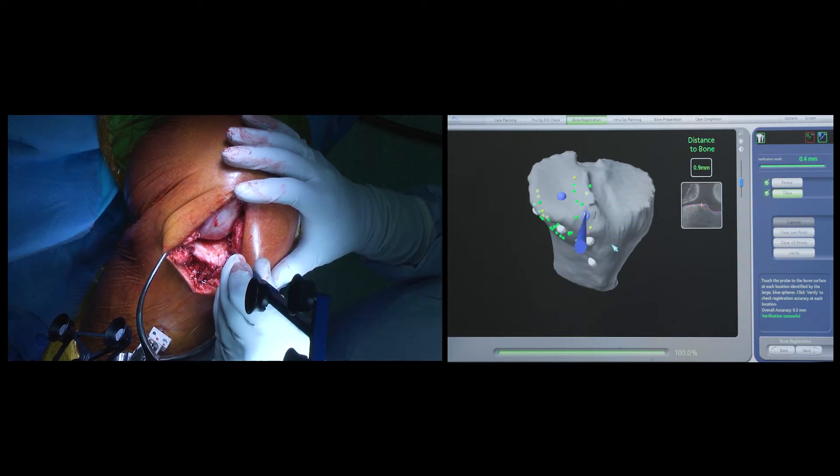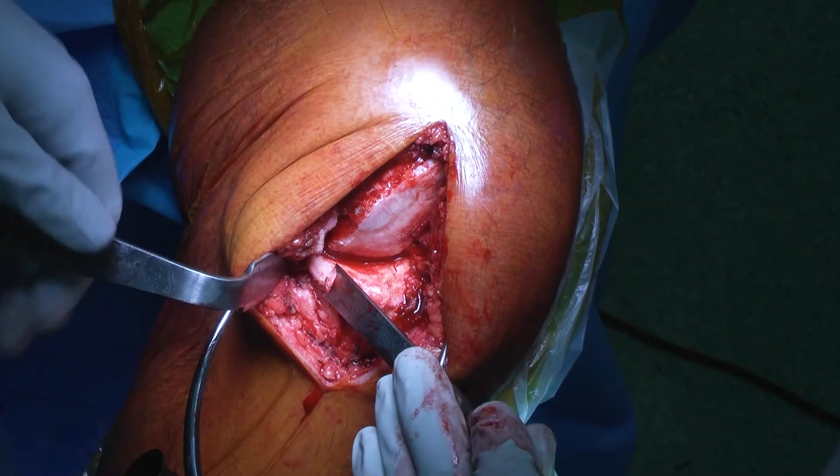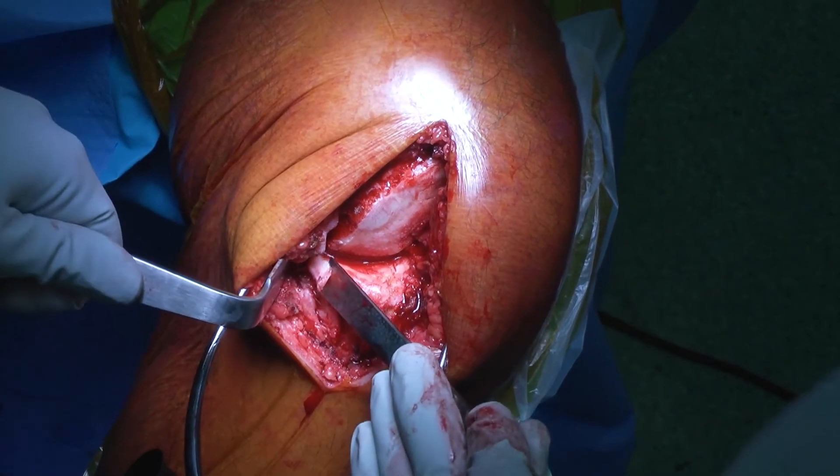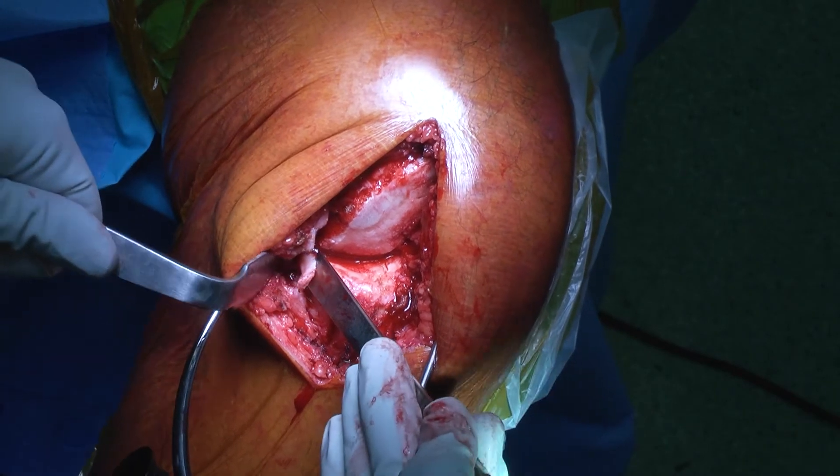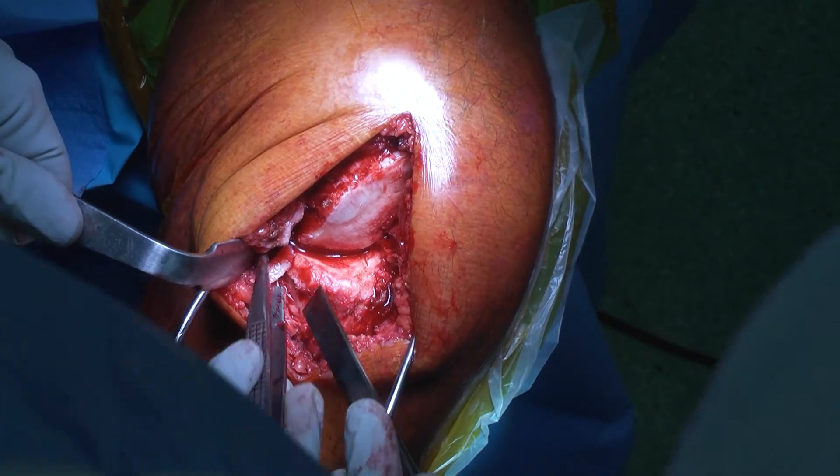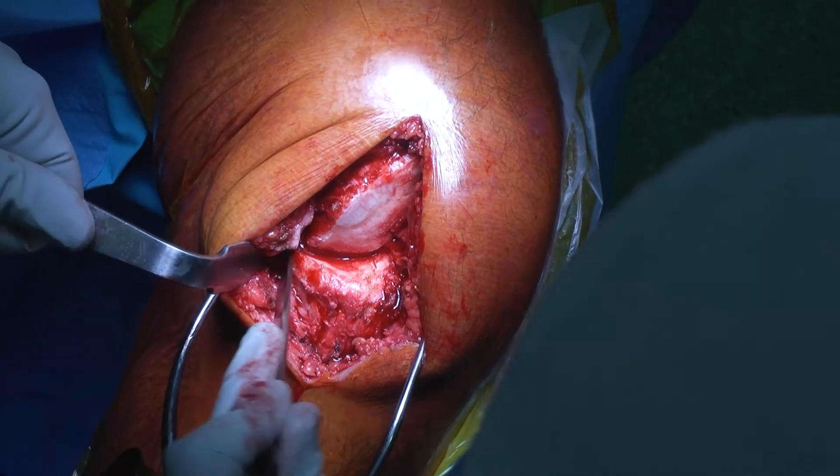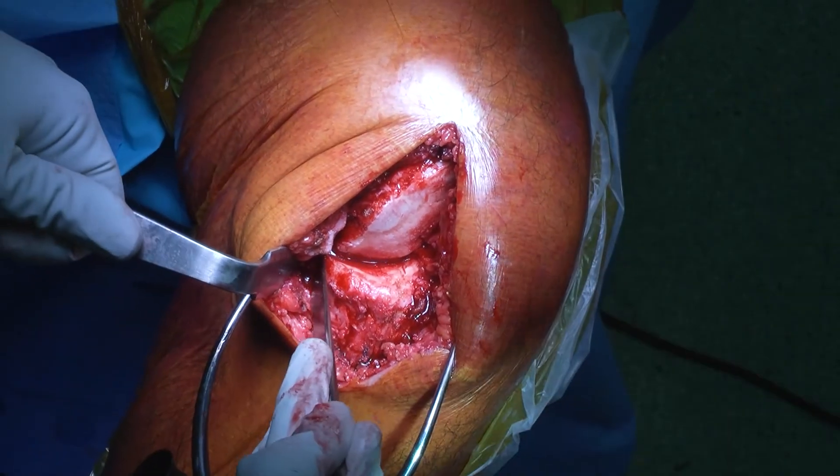Following this, my attention is turned once again back to the joint where I remove the excessive osteophytic bone using a sharp osteotome.